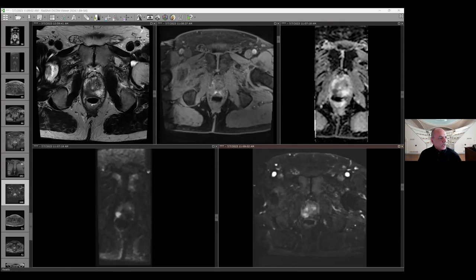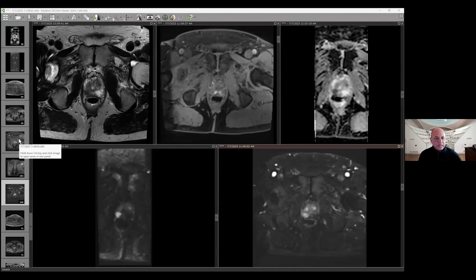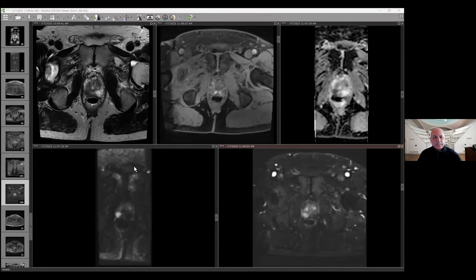Someone asked why do you call that early enhancement. We used to do quantitative metrics with perfusion maps comparing to arterial input function — we don't do that anymore; it's all qualitative assessment. What you do is draw a rough region of interest on that area and temporally plot the time-intensity curve on your PACS, compare it to the contralateral normal side as well as to the artery. That gives you a good frame of reference as to whether the lesion is enhancing early or not. Sometimes just visually looking you may not be able to make the assessment, but doing this quick time-intensity curve does help.